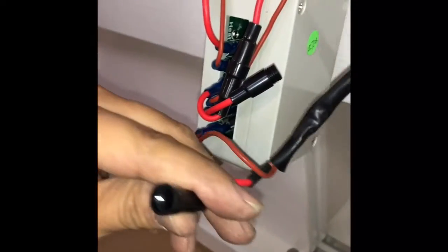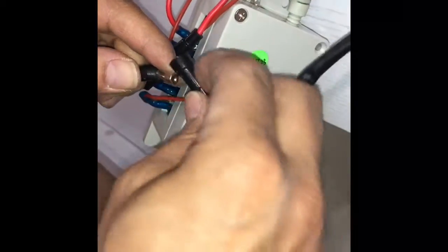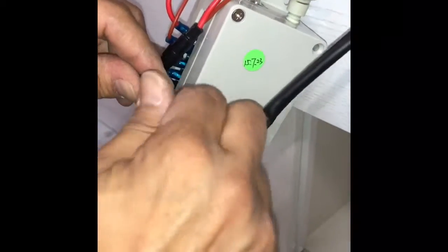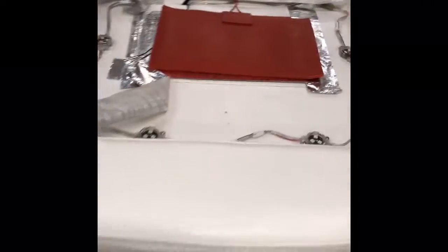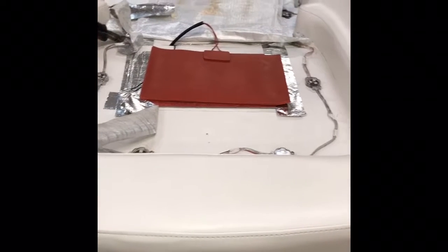We're gonna pull out the wire from the top and we're gonna bring it in. We're gonna connect it to the first, there we go, to the module box. And second, we're gonna go ahead and put the fuse back in there and close it down. So this is the second video for the DX multi-bed.